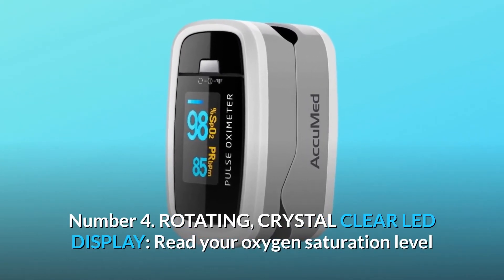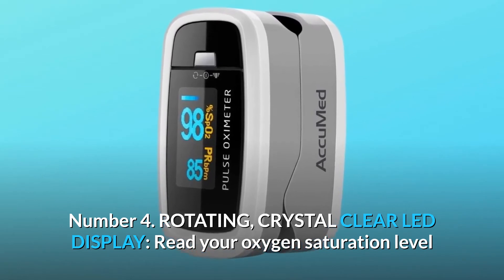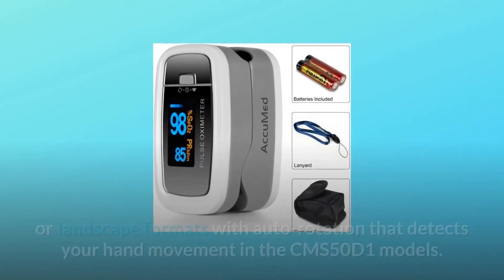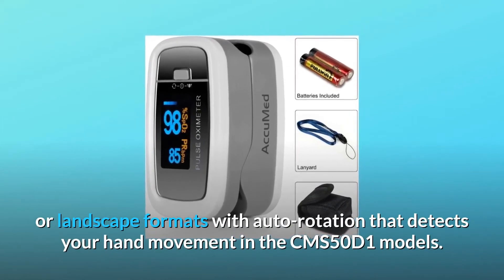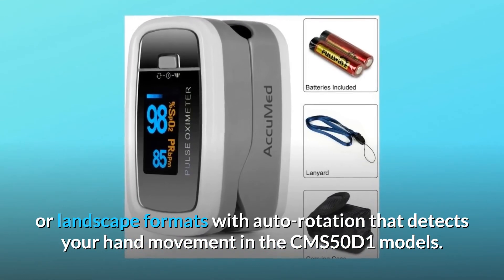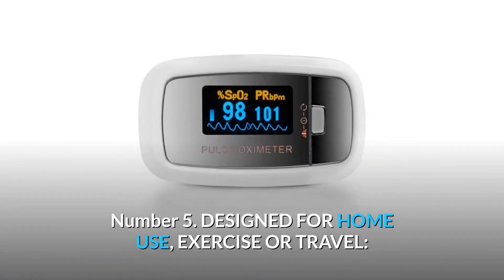Number four: rotating, crystal clear LED display. Read your oxygen saturation level and pulse rate results with remarkable clarity in portrait or landscape formats, with auto rotation that detects your hand movement — available in the CMS-50D1 models.